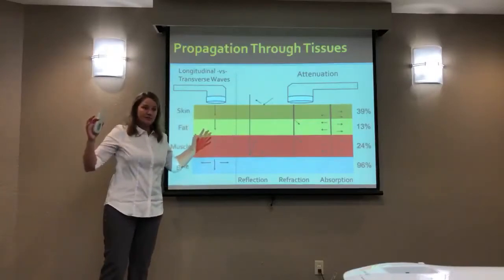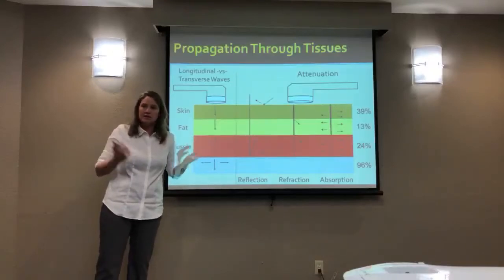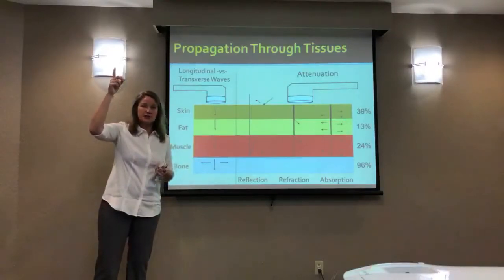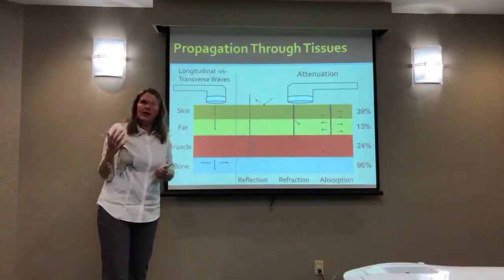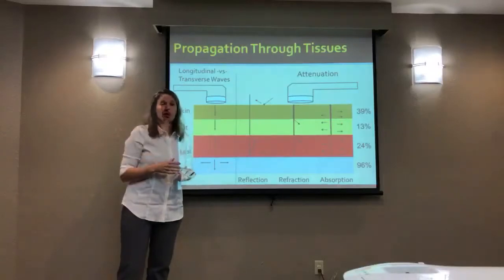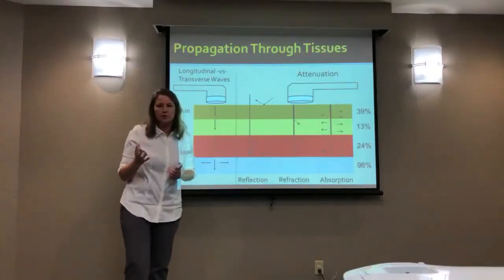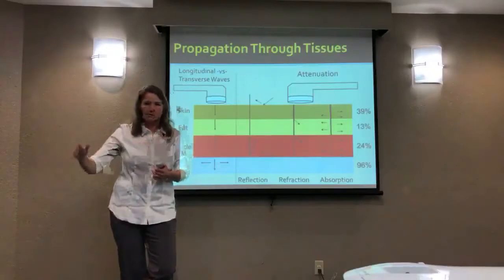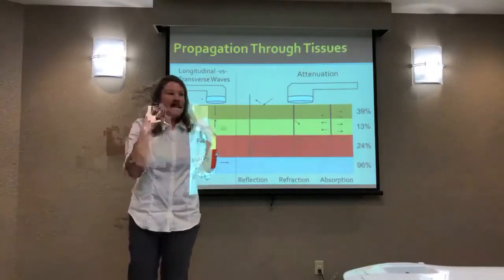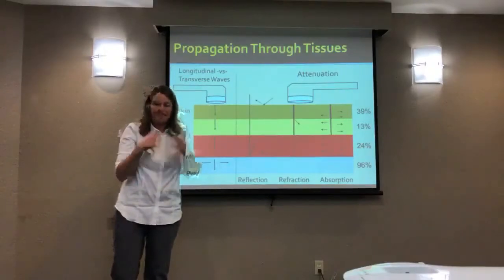So think of it as your voice, you know? These rooms like this are designed for absorbing sound. You've got sound absorbing ceiling tiles, you've got carpet, you've got textured walls. So rooms that are intended to have sound be delivered and not reflective are going to have nice absorbent types of surfaces. Versus if you've ever been in a room, I can remember a whirlpool room where the walls were marble tile, very flat, and the sound bounces off the walls, and you can't hear anything because the reflected vibrations interfere with the original vibrations, and it disturbs all the sound.